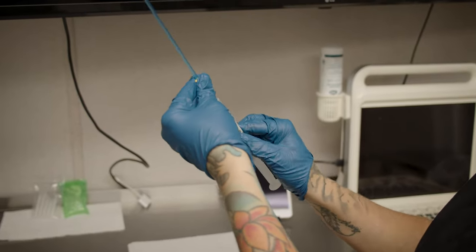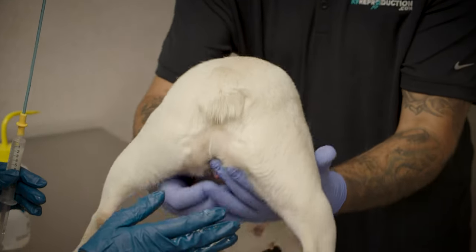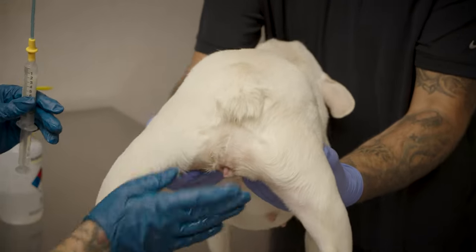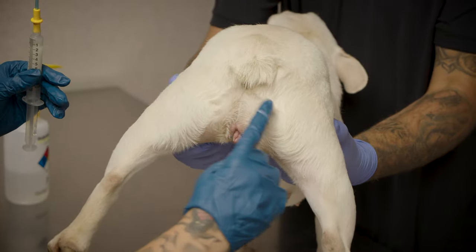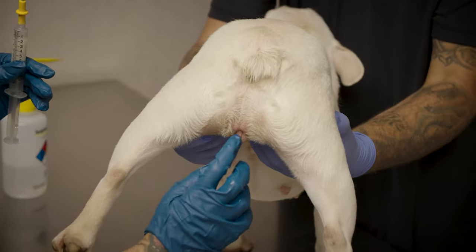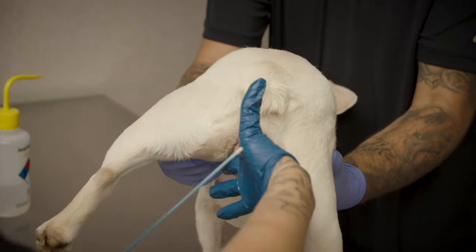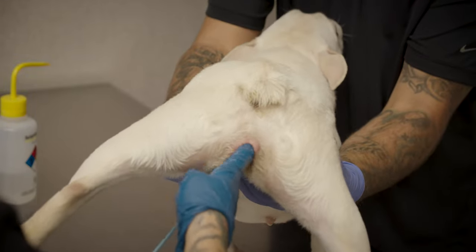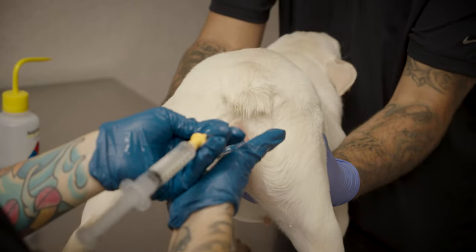You will then attach the flexible pipette to the syringe and begin stimulating the female with lubricant. Once the female is comfortable and receptive, you can insert your finger to use as a guide for the pipette. Make sure you insert the pipette alongside the finger in an upward motion until it reaches the cervix. This should not be done with force — it should be a very gentle process. Make sure that you leave your finger inside to ensure that the semen does not flow out.